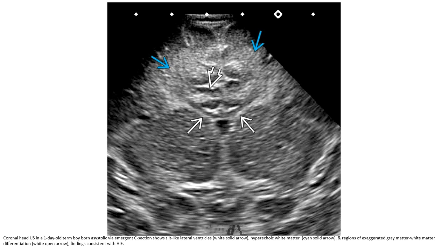Ultrasound in a one-day-old term boy born via C-section, imaging through the lateral ventricle, shows hyperechogenicity and a region of exaggerated gray-white matter differentiation, findings consistent with HIE.